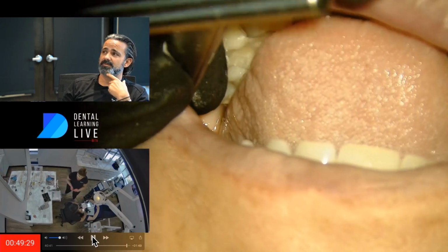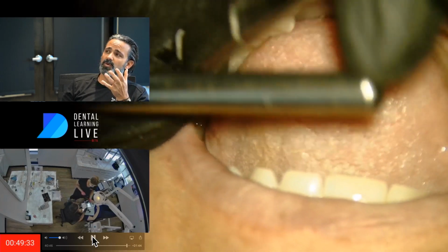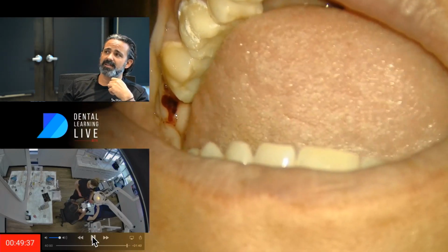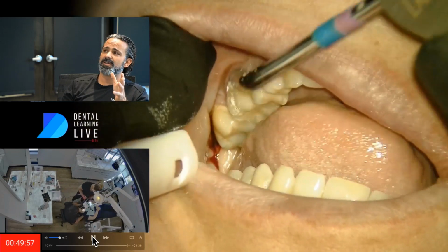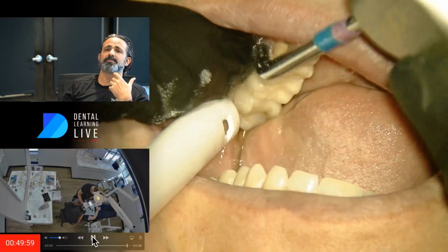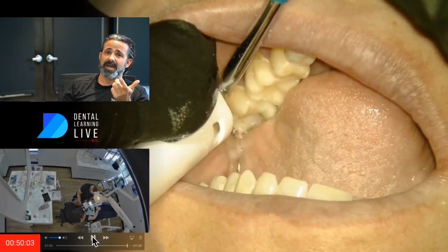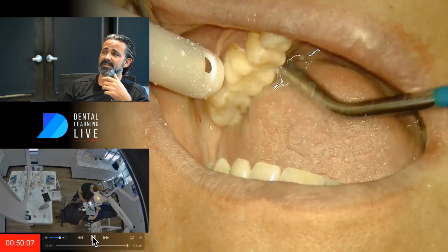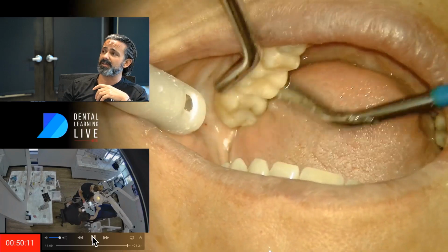There was some difficulty getting this patient numb at the beginning. If I leave an X-tip in, it's a little bit stubborn to get out at the end, but you can do that. But I leave it in on occasions when you worry about any issues with anesthetic, because it's easy to give it back with the rubber dam in place. And so you never have to try to do anything different or poke the patient again. You can just use that same cannula again.